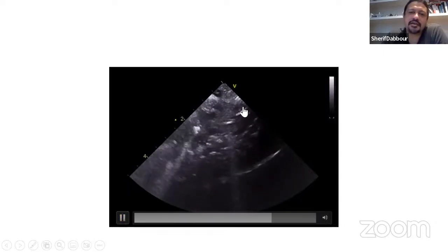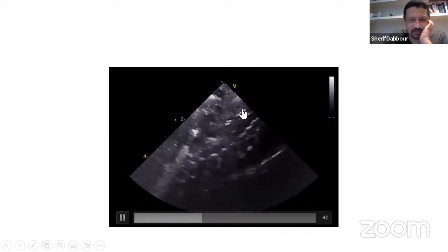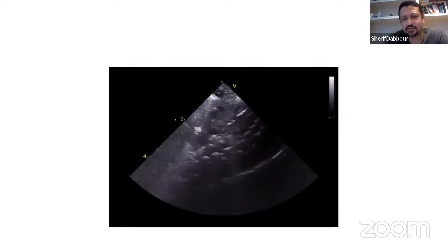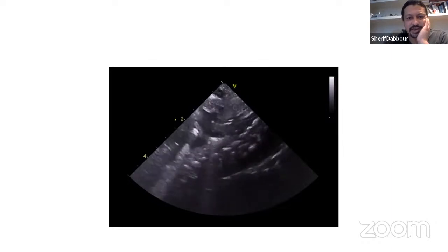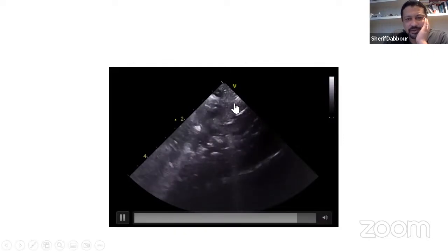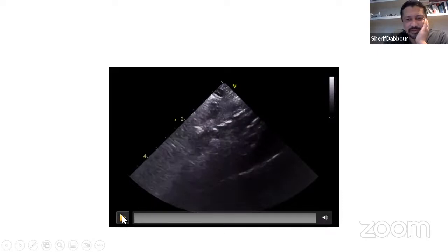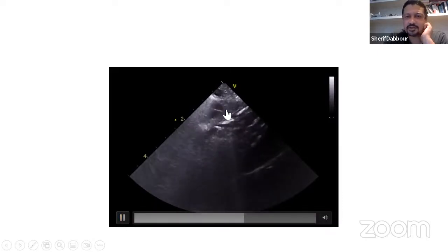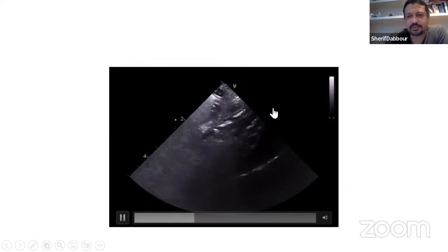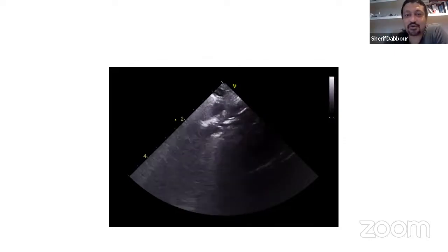In this video I just tried to visualize an ET tube, because I was told it was just pulled out. I couldn't use a linear probe because it was too big for the baby, so I used a cardiac probe, trying to get the aortic arch and see the ET tube, which I believe should ideally be 1 centimeter from the arch of the aorta. I could appreciate it on the top here. I tried to repeat it again, and I could see it here. Air entry was equal clinically on both sides, so I presume this is in a good position. And you also had equal lung sliding on both sides, which could also help you. Yes, equal lung sliding.